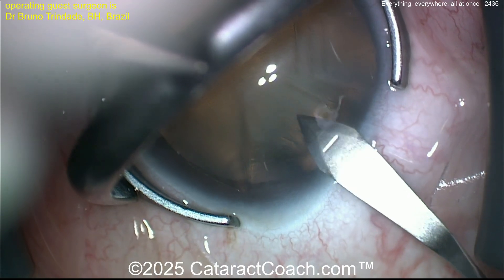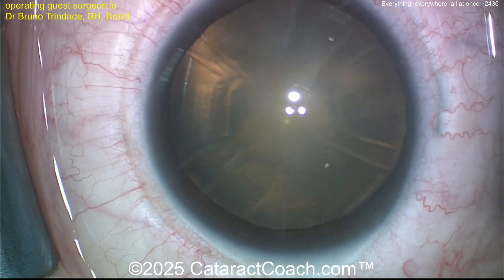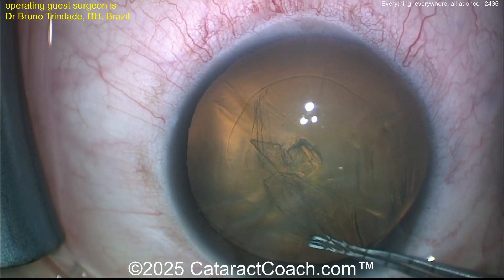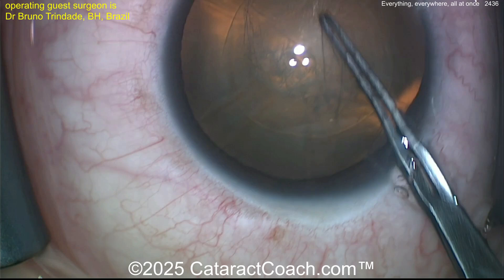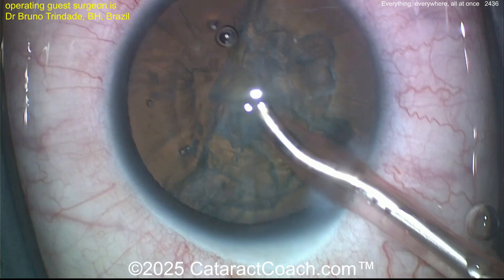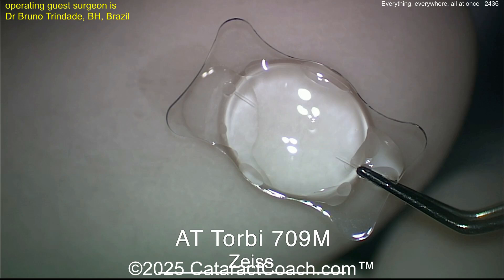Making the phaco incision here — smart, putting it right between the RK cuts, not intersecting them. Getting a nice capsulorhexis done here, and then nucleus removal will be next. Taking out the cataract — that goes very routinely, pretty smooth.